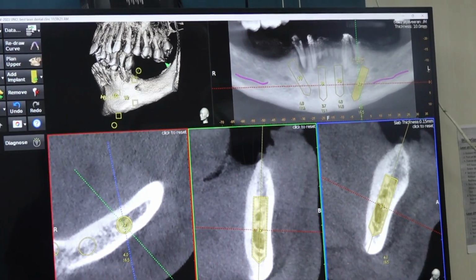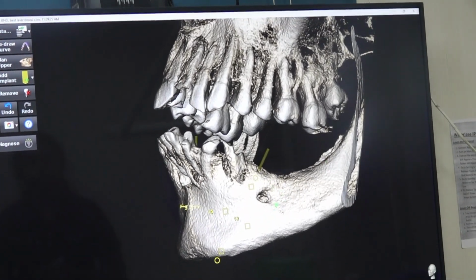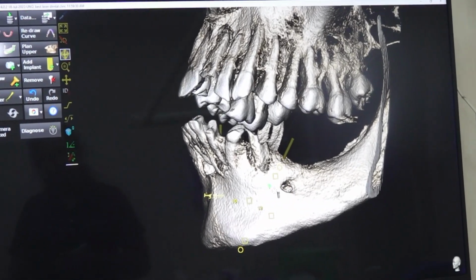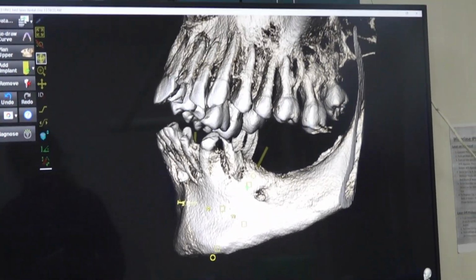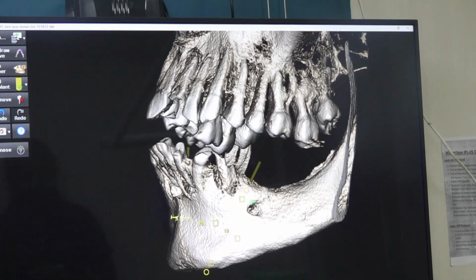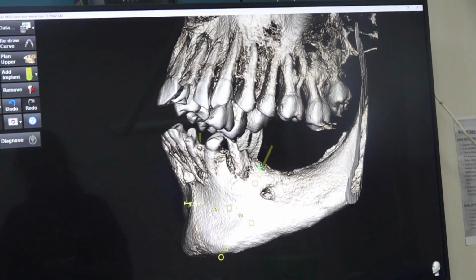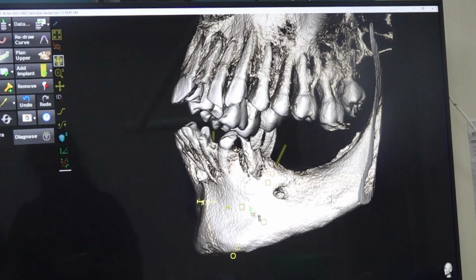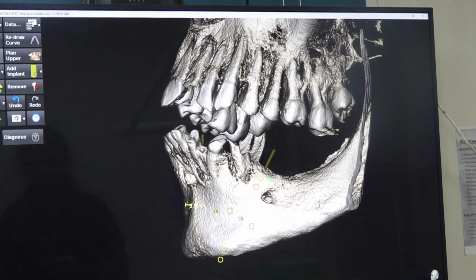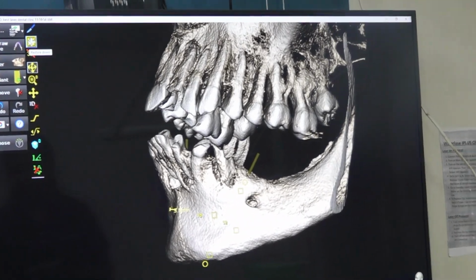Almost like 35 degree. So the key is during surgery you have to expose the mental foramen, mark the mental foramen, and in front of it mark 5 mm with the pencil, and that is the drilling point. Using a tapering implant will reduce the risk further, because crestally it will be wider, but as it goes apically the diameter will become less. If you use a parallel implant, then the risk of damaging the mental loop is more.